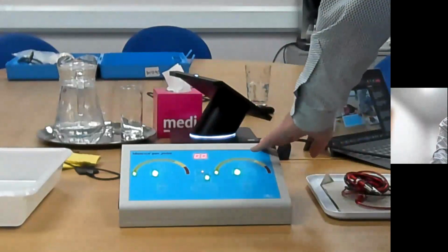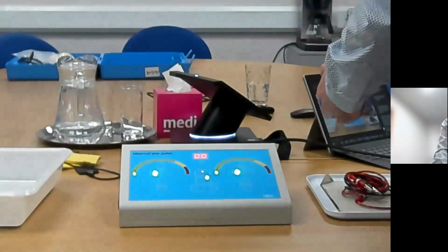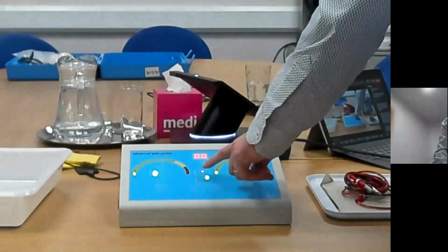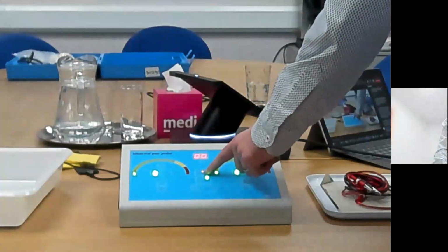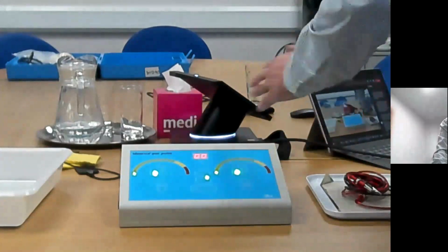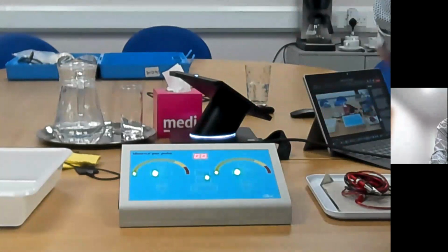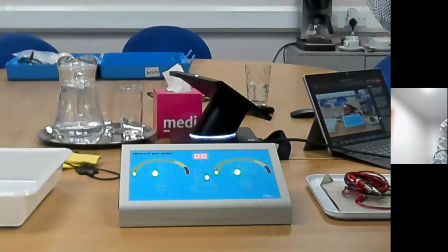It's a good practice for the device anyway, to make sure that you charge it at least once a month, even if it's not being used. When you do switch the device on, it defaults to pulse current. That's that orange light in the middle there. Most of the time, you're going to want to switch that pulse light off so that you get direct current. Pulse current means that it's on for half the time and off for half the time. So make sure for most people, certainly for all adults, that you turn the pulse current off.